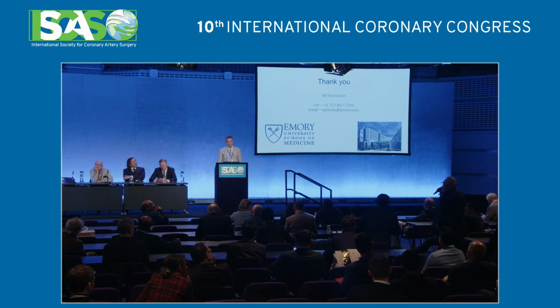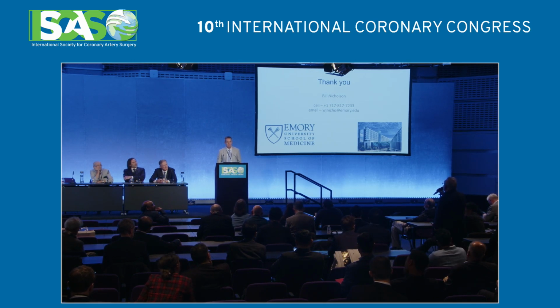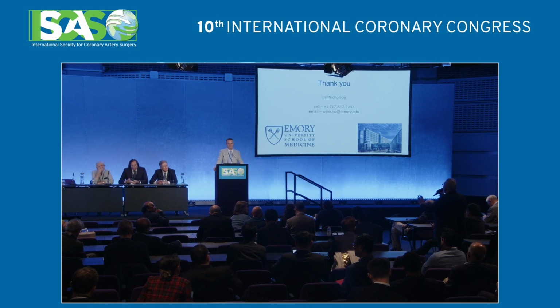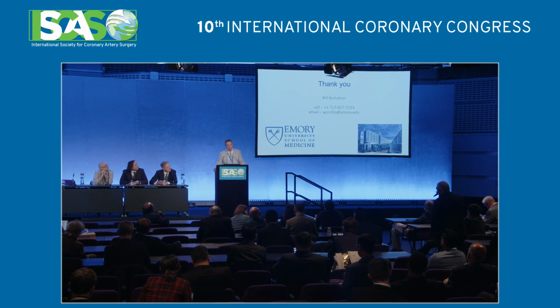And although lithotripsy is making good progress, and now we have lithotripsy without balloon, which is going to be really important for us, I think that the amount of calcium that you see on CCTA is becoming, for us at least in Galway, a deterrent for PCI. I'd say the amount of calcium in general has been one of the more phenomenal increases that I've seen in the last 10 years.